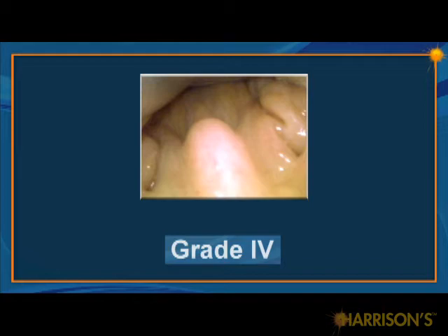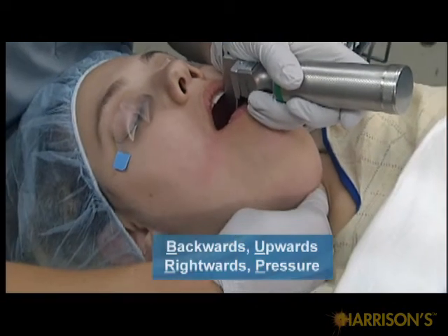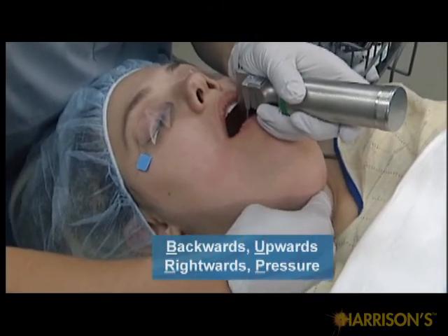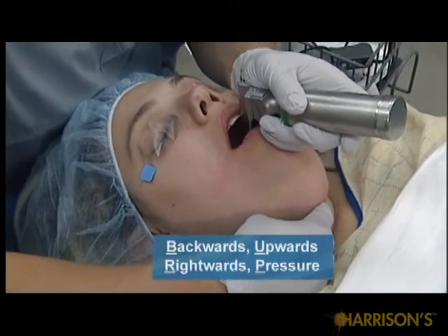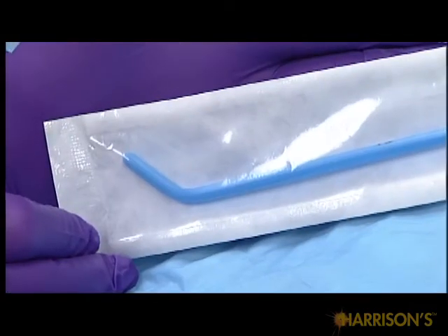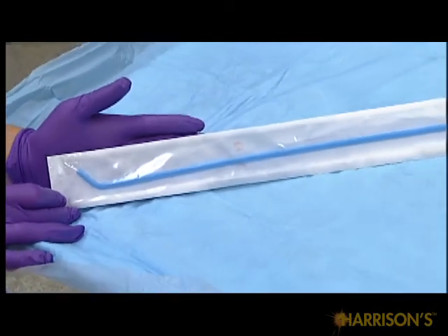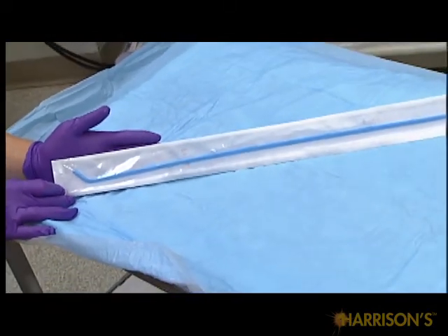If the view of the cords is still suboptimal, troubleshooting is necessary. Often BURP, or backwards, upwards, rightwards pressure, can be applied by the practitioner to the trachea to improve the view. In addition, if the practitioner is able to see a grade 2 or 3 view, but is unable to pass the endotracheal tube, use of an Eschmann stylet or a bougie, which is a long plastic stylet with its end curved anteriorly, may be considered.